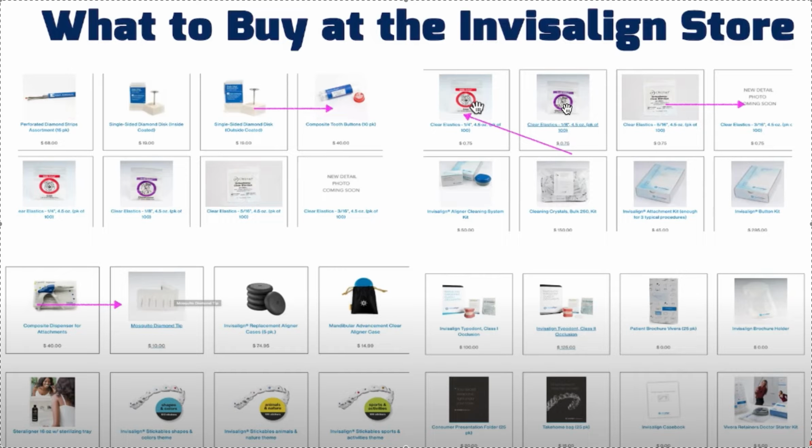Other thing that you may or may not want to get would be their attachment material. It's basically just composite. The gun is about $40, and the capsules, I think I looked, they were like $70 for 20, so it's about $3.50 each, and I think one is usually about per arch, so about $8 per patient. Not great. You can use any type of composite.